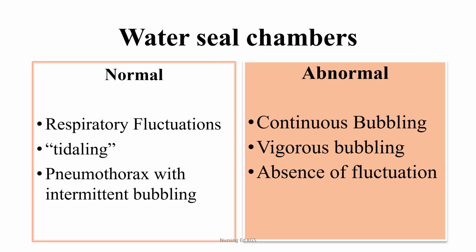A normal finding in this water seal chamber is what we call tidaling. And this is when the water in the water seal chamber will rise with inhalation and fall with exhalation. This tidaling lets us know that that chest tube is patent, it's working as it should be.